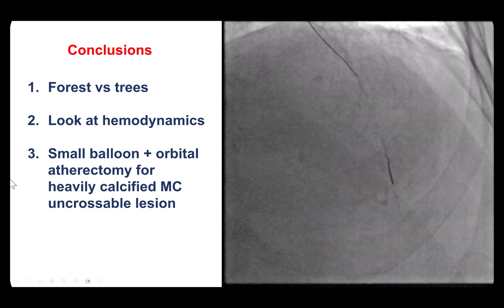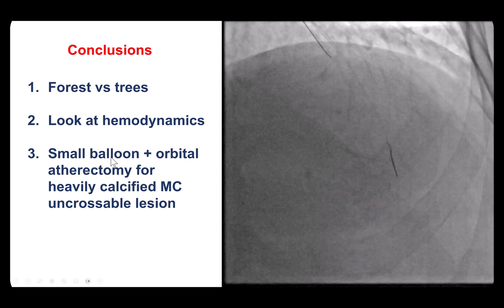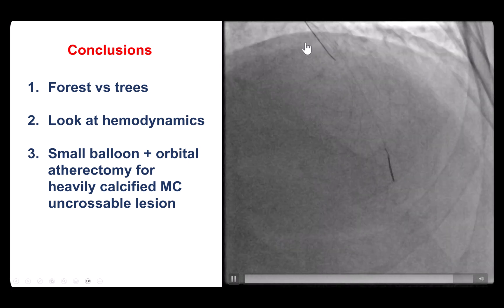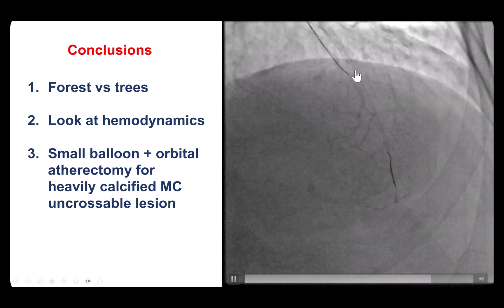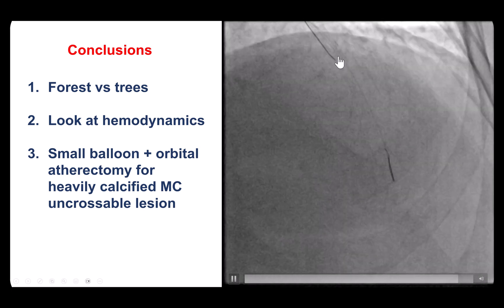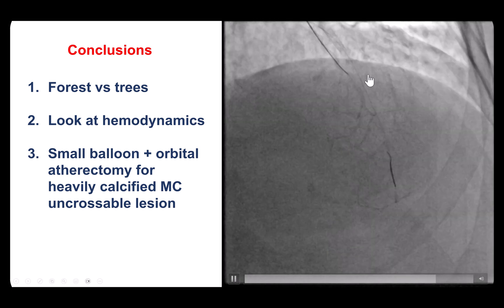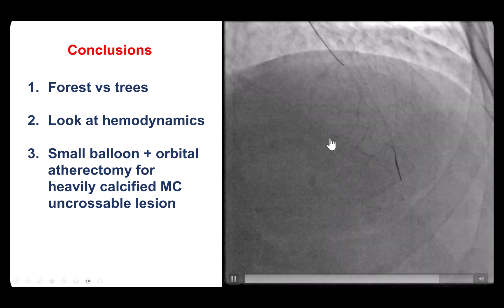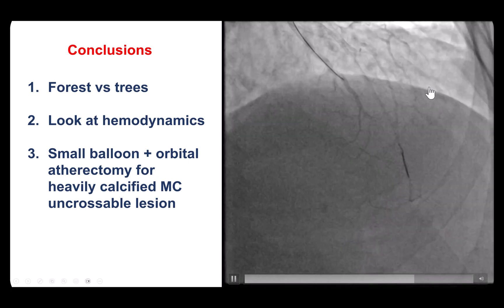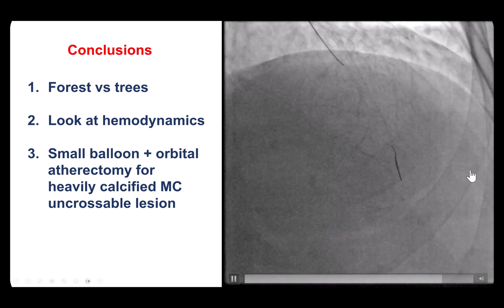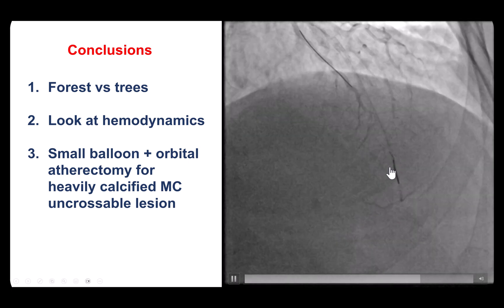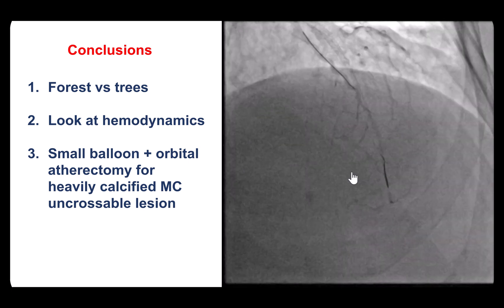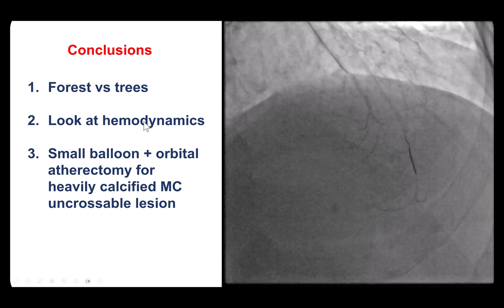Several lessons from this case — both from the coronary part and beyond. Regarding the coronary, we had a heavily calcified short CTO. We were able to cross with antegrade wiring, but it was balloon uncrossable, and those lesions tend also to be balloon undilatable. We used a small balloon to deliver a microcatheter, delivered an atherectomy wire with a Viperflex tip, performed orbital atherectomy, and that facilitated good expansion of the balloons and stents. We also observed flow reversal after crossing the LAD CTO — flow that was mainly through ipsilateral collaterals decreased, and flow started coming mainly through septal collaterals.